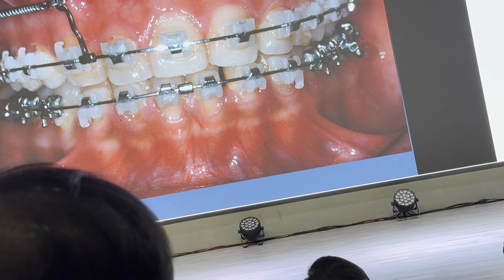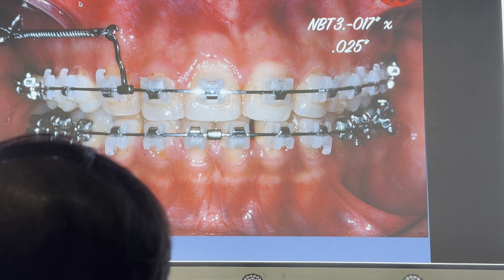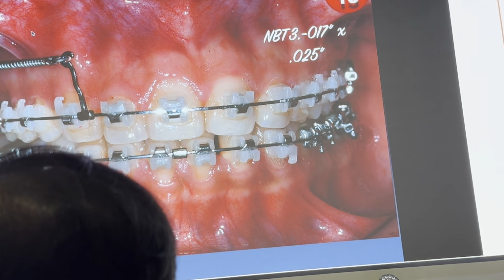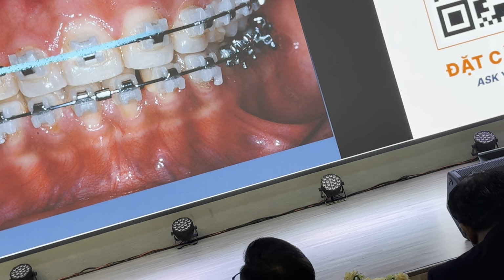And now you can see on this side, we are using a hook, and the height of the hook is going to be changed during the treatment. Because the motion of these teeth is going to be different as you go along.